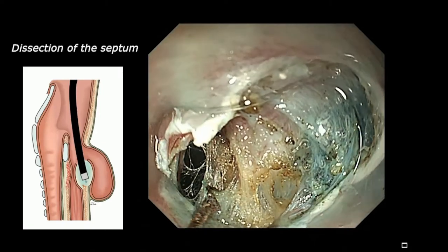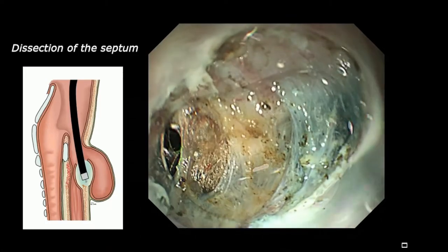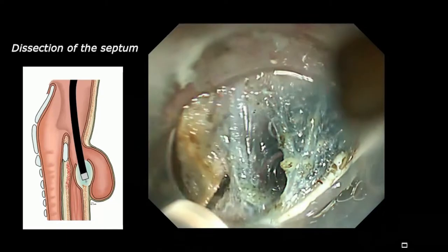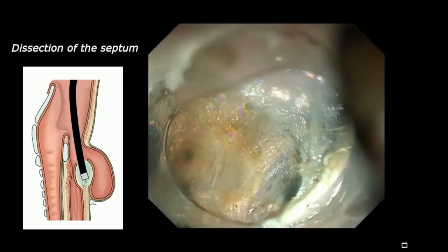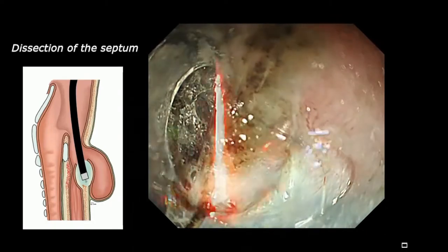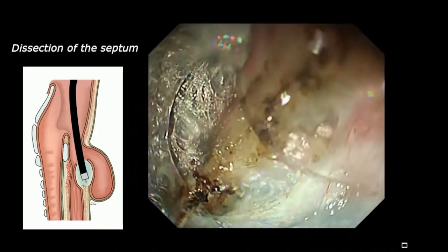Now we are dissecting the muscle fibers using spray coagulation at 50 watts effect mode. Previously when we cut the mucosa as well, we were very afraid — too much cutting and the mediastinum could open. But in this procedure, same as a POEM procedure, we cut only the muscle layer. So even when we cut deeper, definitely no problem because we preserve a lot of mucosa which covers the defect.